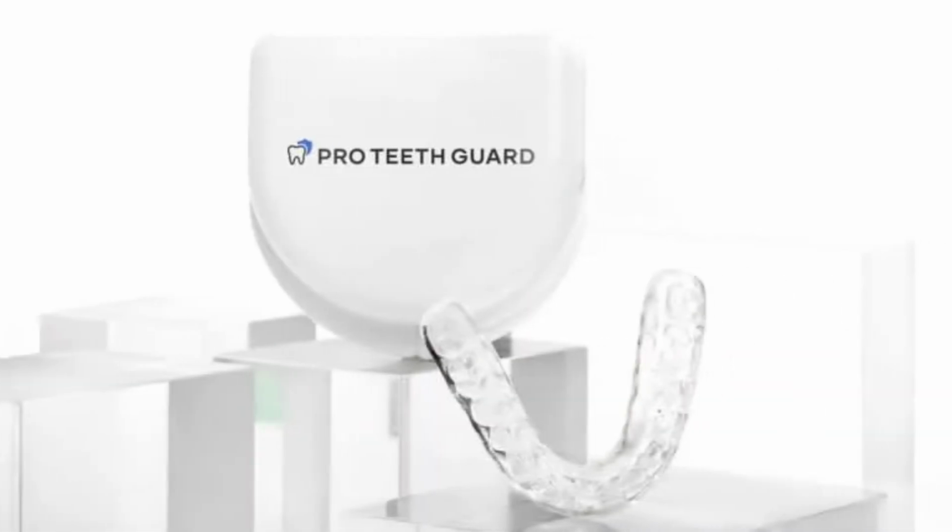Evaluate the bite of the patient and give a night guard if required. If the patient is a bruxer or has a very thick masseter, or has clenching habits, and even if they don't have it, try and give a night guard in every case, because that saves lot of trouble later for the patient and for you, and increases the longevity of the implants.